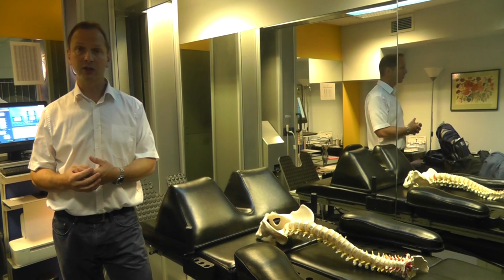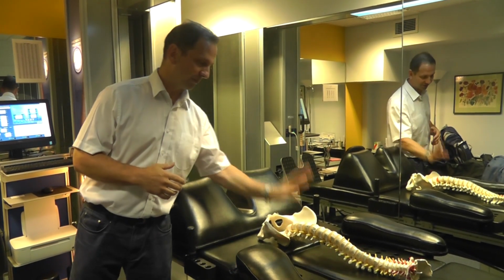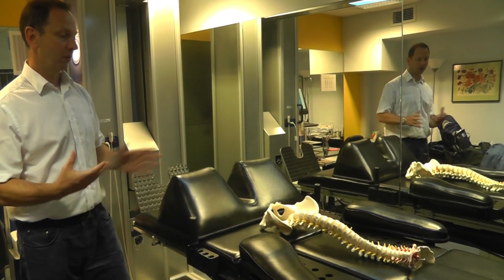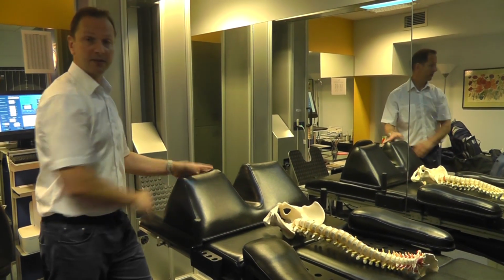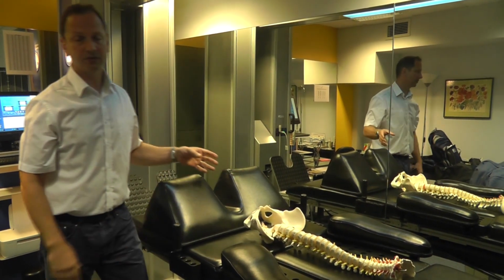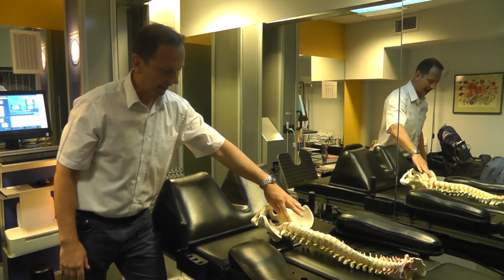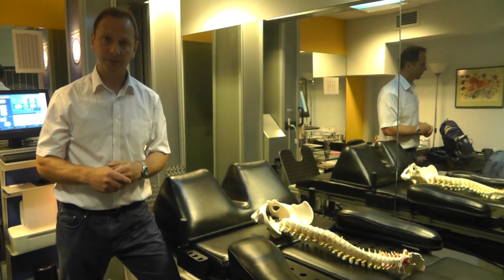People often ask me how we treat targeted spinal segments. Here we have part of a patient lying supine on a table. With IDD therapy, we begin by placing the patient's knees over this cushion, which we call a Toblerone cushion, to flatten the lordotic curve. We're going to use distraction and mobilization forces at specific angles so that force is directed to specific levels.